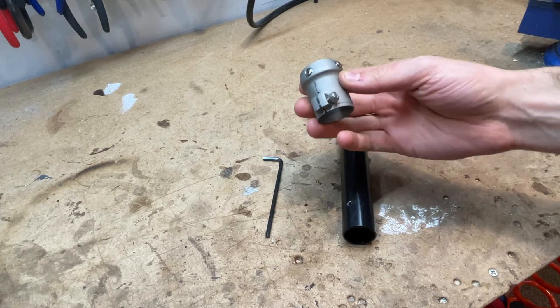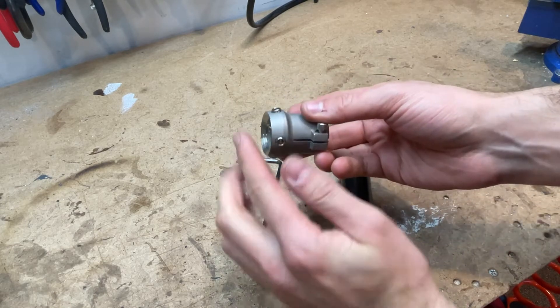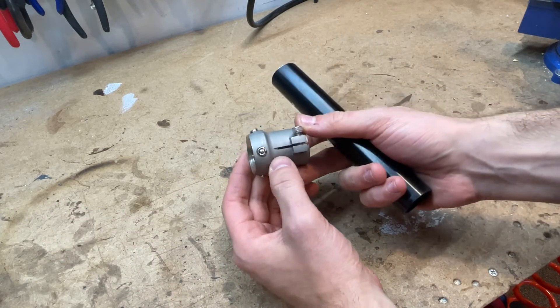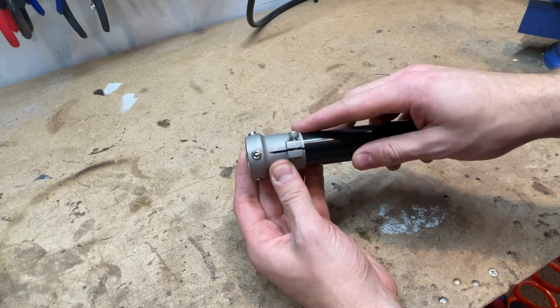The first step is you're going to grab a number four allen key — these are readily available at any hardware store. Again, pretend the jacket is off to the left here. You're going to take your leg, make sure you have the slot facing towards you, and insert the leg about halfway.